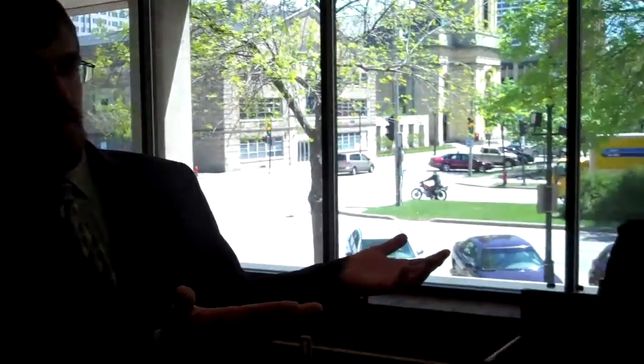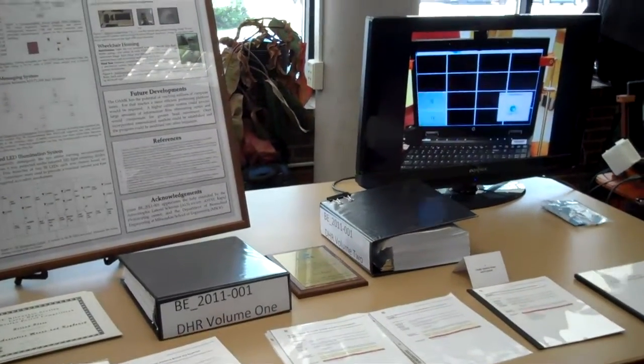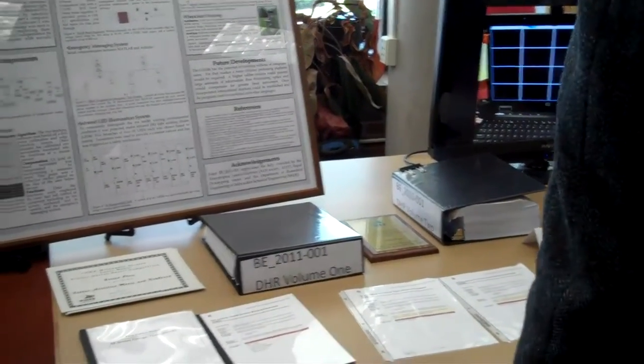Alright, so we have an ocular system mouse and keyboard, which essentially equates down to an eye tracking system. What we have is a wheelchair with a computer and a web camera that faces into the user's eye. It's approximately 6-time optical zoom, which allows us to get close enough to the eye where we can measure movement of the actual eye and the eye moving around. We use infrared lights to supply a constant light source to the eye, and we filter out all other visible light through a filter onto our webcam.